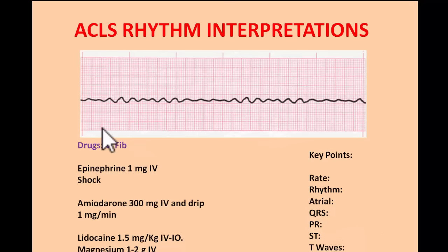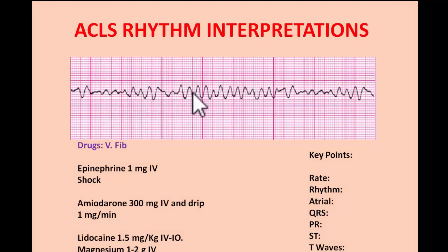Here's an example of a fine ventricular fibrillation where the undulations are very narrow, and also the amplitudes are small. This is suggestive of almost like a terminal rhythm, or this is something we see following an acute myocardial infarction, that this has to be very aggressively treated with epinephrine, amiodarone, defibrillation. Here's another example of a fine ventricular fibrillation with a little more visible QRS complexes, but nonetheless the prognosis in these patients is very poor, and immediate treatment is of the essence in establishing stable cardiac rhythm.